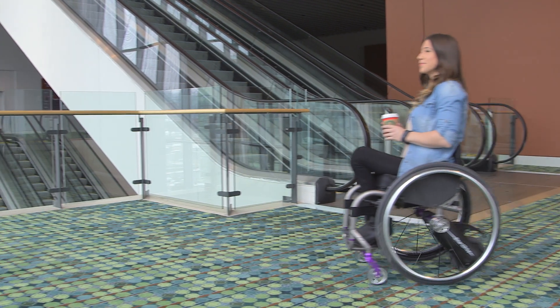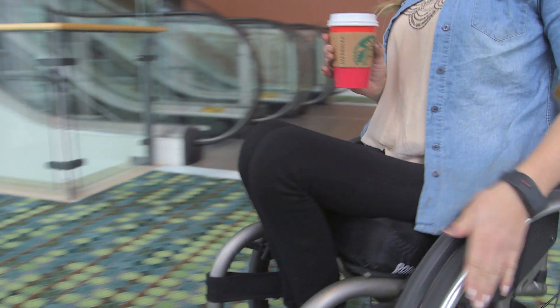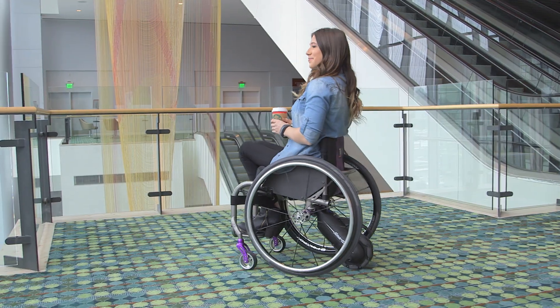To stop the motor, just tap your hand and you'll coast to a stop. If you need to stop quicker, just brake on the push rims as usual.